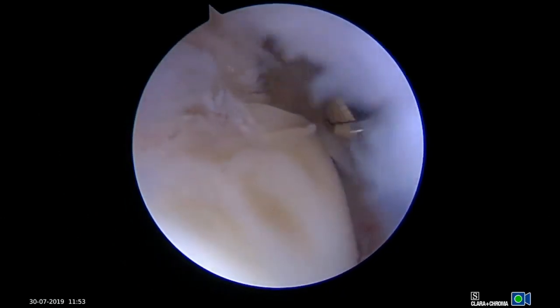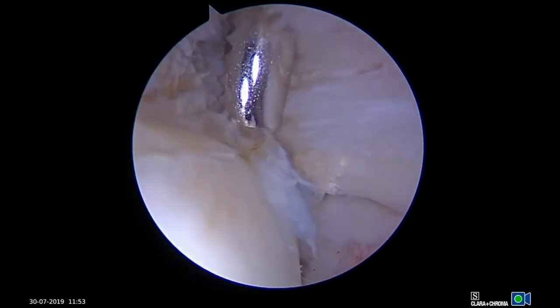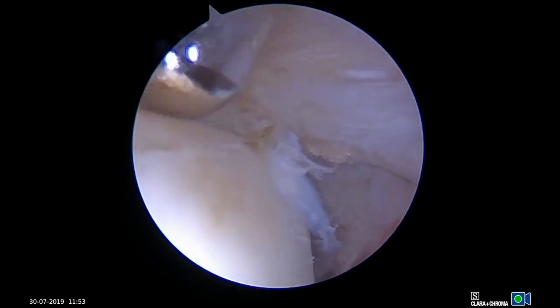A 3.5mm shaver is then inserted through the subacromial space, through the bursal split and into the tear. While viewing from the glenohumeral joint, the tendon edges are debrided and the footprint for anchor insertion is prepared.